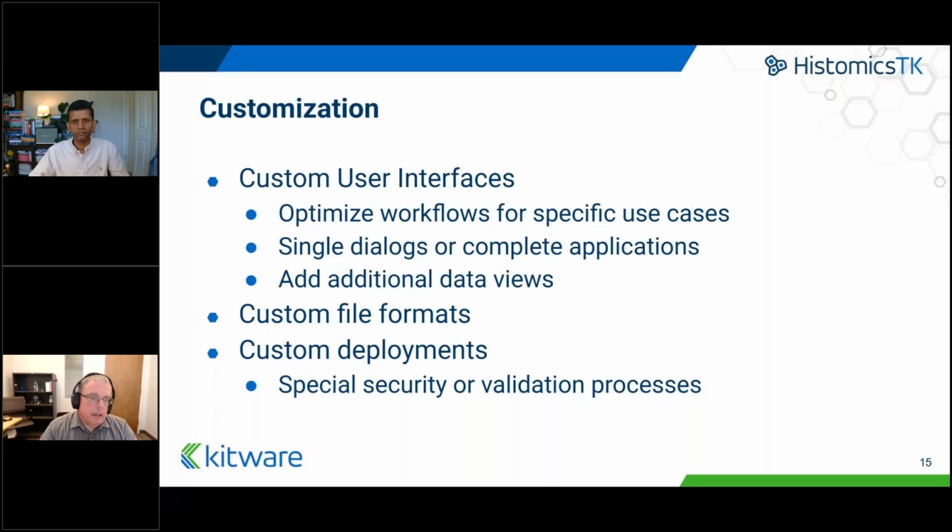And for deployments, I mentioned that we can deploy this using Docker or in certain HPC systems. All of this can be tailored as your organization needs. For example, we had one organization who wanted to make sure that they ran a malware detector on anything that was uploaded. So they have a malware plugin that will do that, and they want to go through a bunch of other certifications to make sure that they were conformant to their industry's, their particular organization's, security practices. And so all of that can be handled as needed.